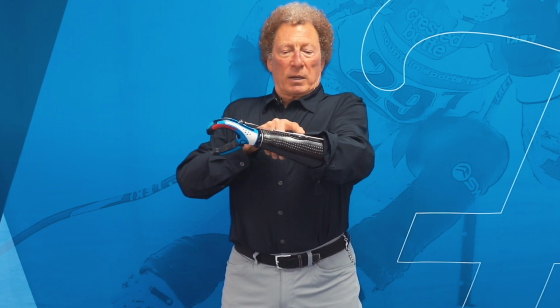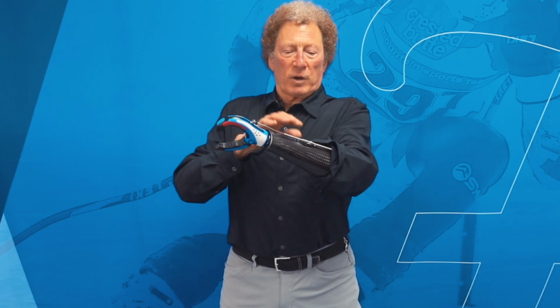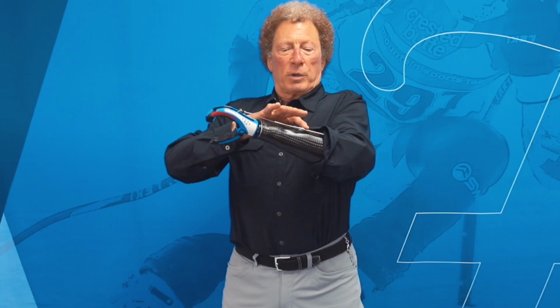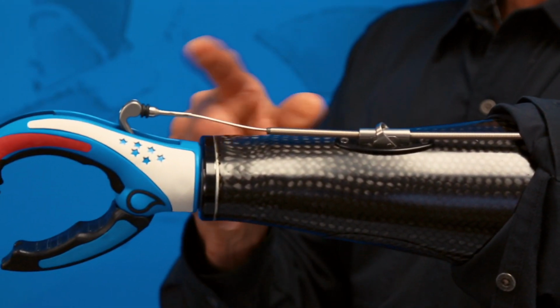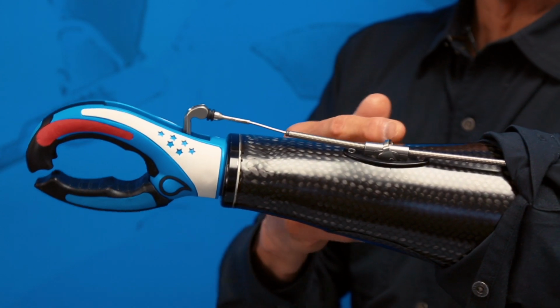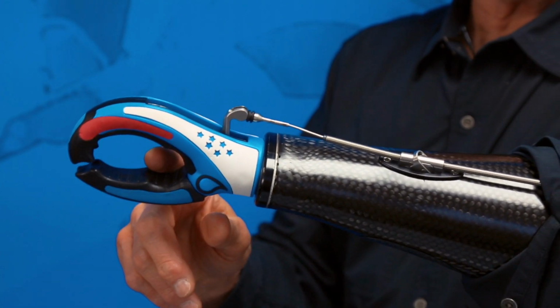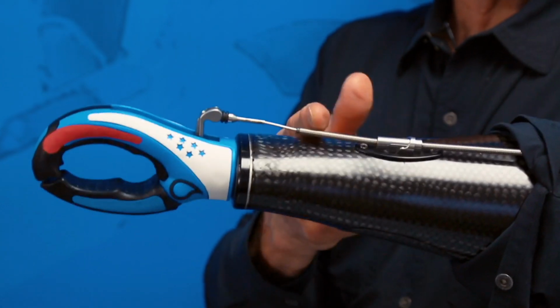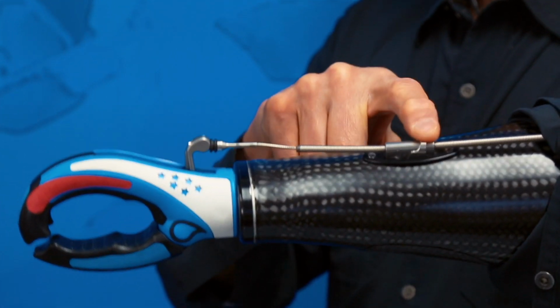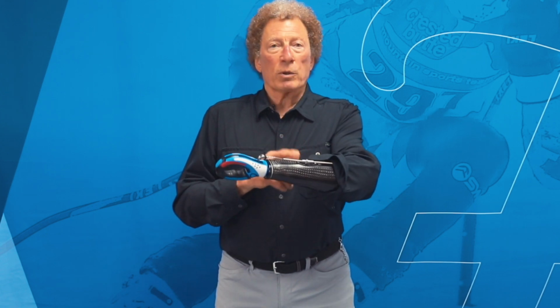It's a cable connection. It's a cable locking system. So rather than locking the terminal device, we're locking the cable in place. So by a simple motion of my hand, I can engage a small cleat. It allows this cable to move proximally, but does not allow it to move distally. So one of the advantages to that with voluntary closing and all of our prehensors is that this gives you the ability to close and to hold on with no additional cable tension, no concentration involved. And that's a real important aspect.